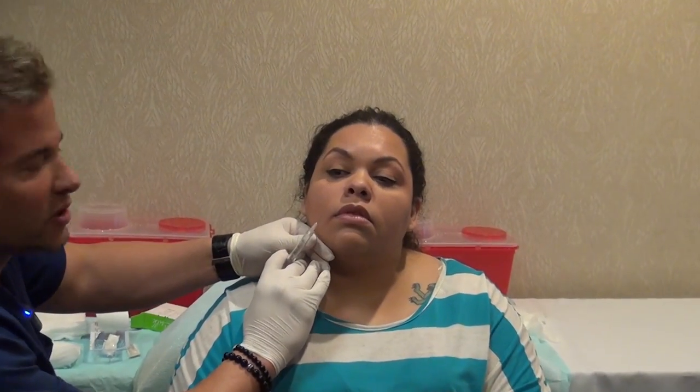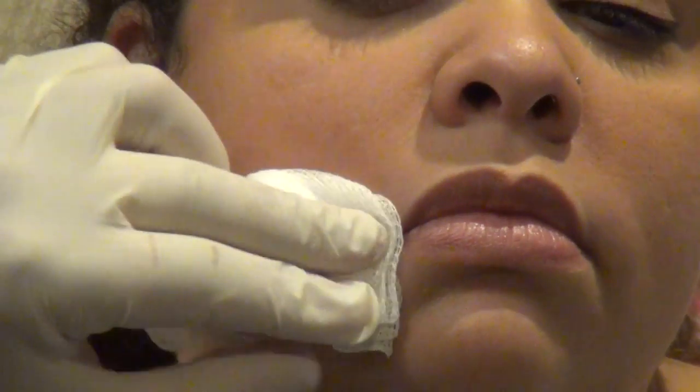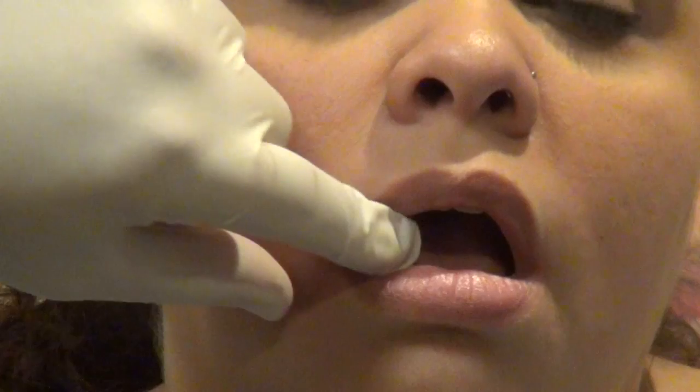Let's do a little more — we're going to do linear threading and the fanning technique. Since you want to get coverage here, you enter a little bit lower. She's a great patient, not moving around. Everybody can see the fanning technique — there we go, nice. You can see that result. I'm going to go to the other side. Open your mouth for a second — always check, sometimes the product can come through on the other side. Make sure you're molding and palpating around. When I'm about two-thirds done, I'll give her a mirror.